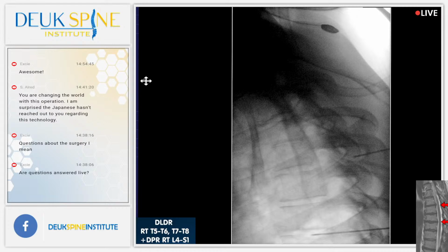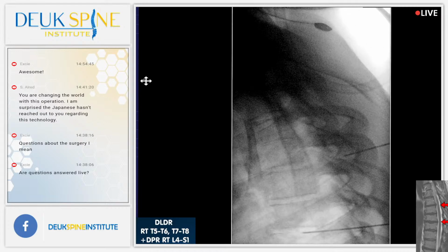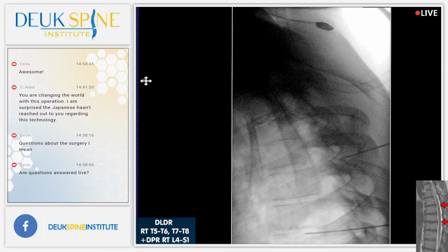Oh, interesting. Shot? You okay? You're doing great. Shot? I'm just having a hard time getting around the facet. See how the facet may be a little bit off? I wonder if we can adjust the orbit, because there seems to be some rotation between 5 and 6.